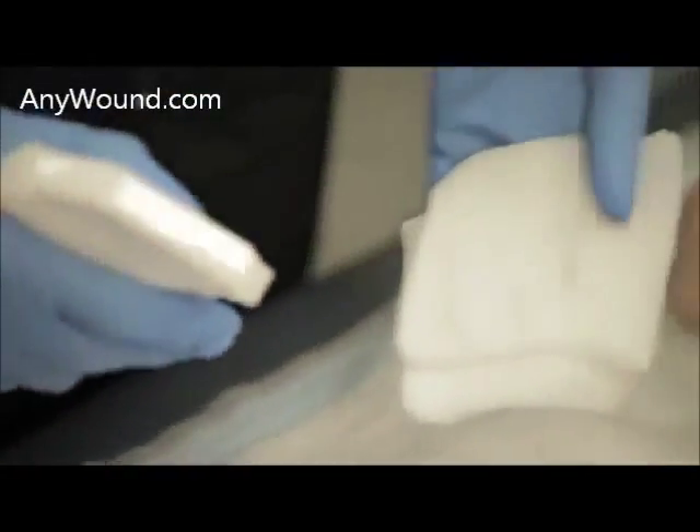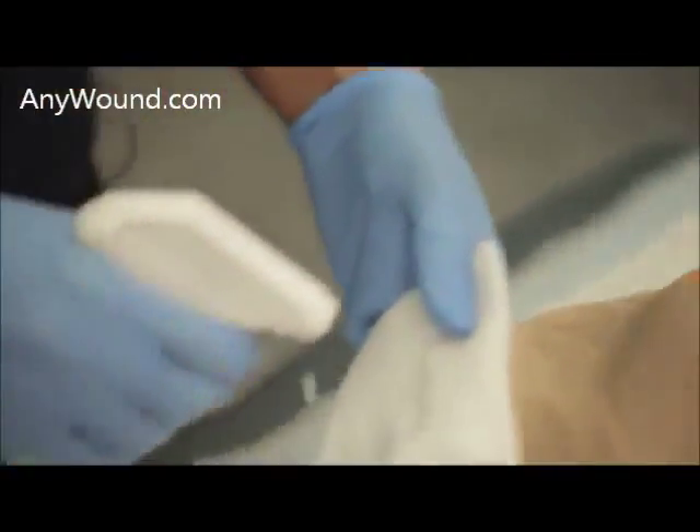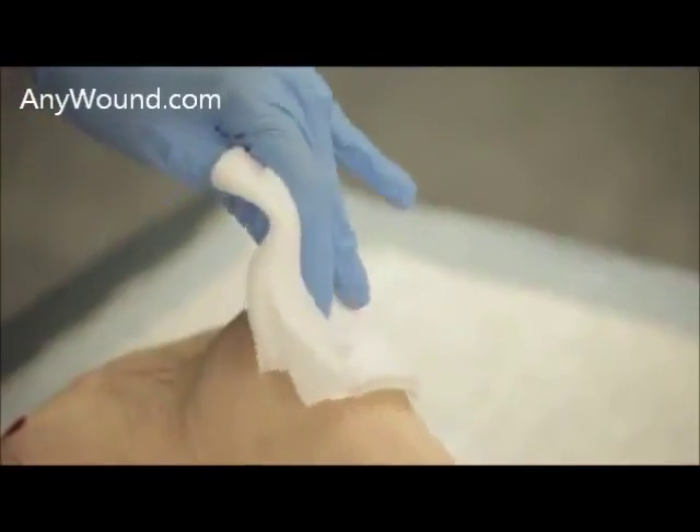One of the first things to do is cleanse the wound, either spraying the wound directly or spraying the gauze and then cleansing the wound.